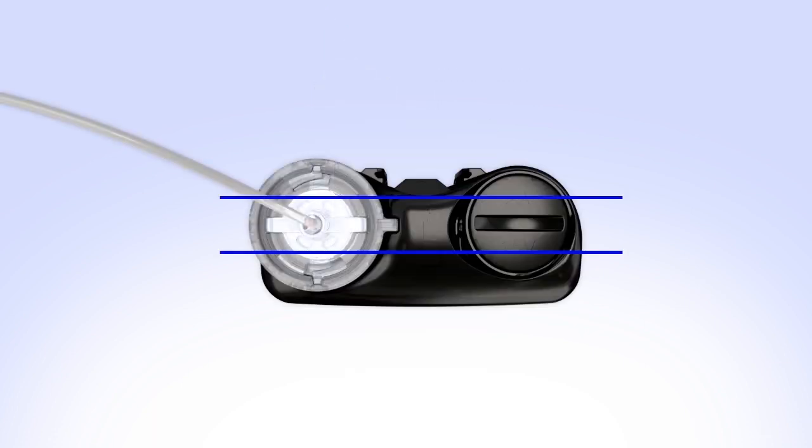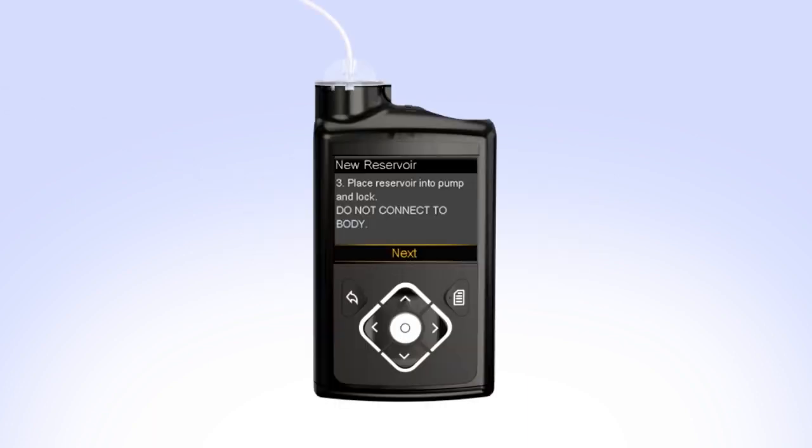The tubing connector should line up with the groove in the battery cap of your pump. On your pump, select Next to go to the Load Reservoir screen. With Load highlighted, press and keep holding Select until the screen shows Complete. When you see Complete, Do Not Connect to Body, and a yellow checkmark on the screen, select Next. You will now fill the empty tubing with insulin.